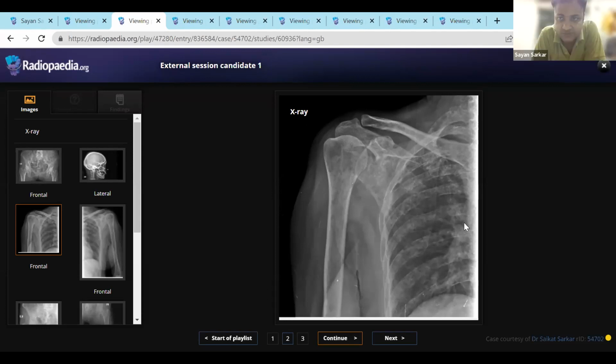What are you expecting from the CT chest, abdomen, pelvis? To look for the extent of the disease, and a bone scan is also suggested. How does multiple myeloma appear on bone scan? It will appear as cold lesions. It will not show uptake because of the lytic areas.